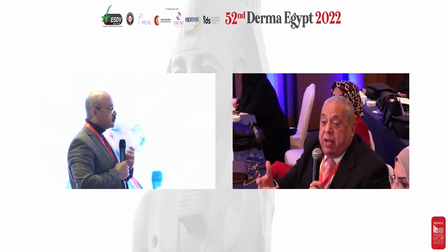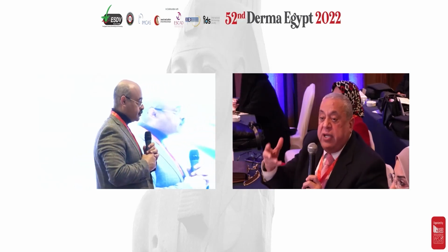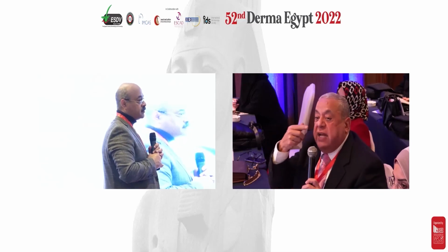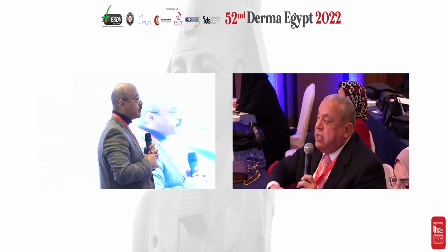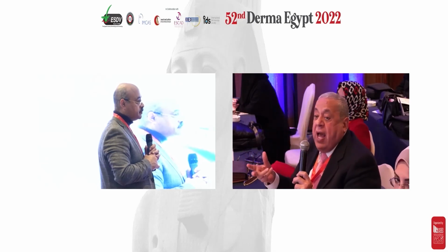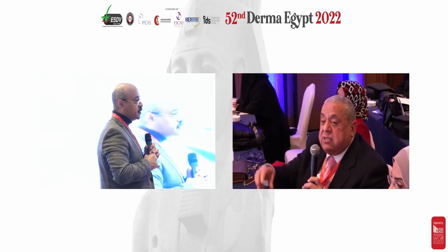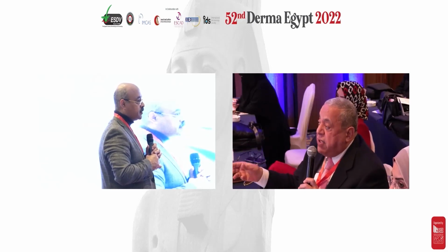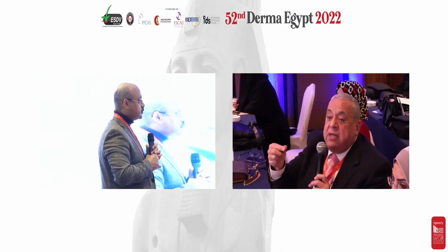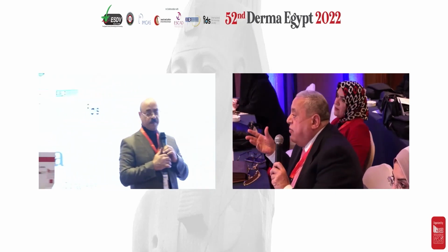So can we cover the probe with something exchangeable like that? Do you remember the disposable cover for the thermometer? Yes, we can cover it with cling film, very fine cling film. I do that and I advise it. Always cover it, remove it, and sterilize the probe with a piece of cotton with Sidex. But about the particles, I don't know.